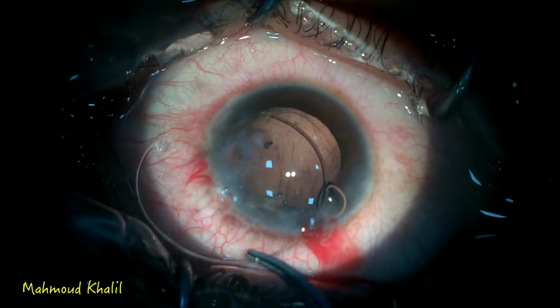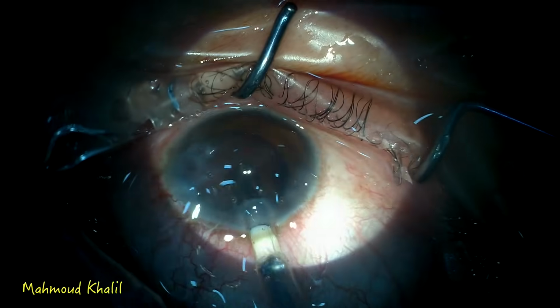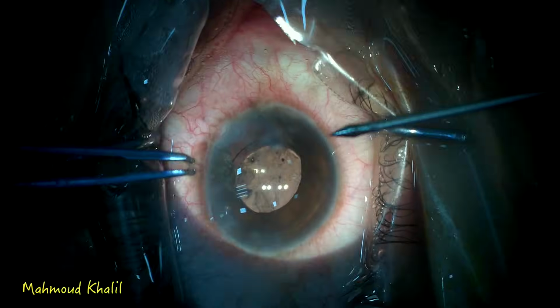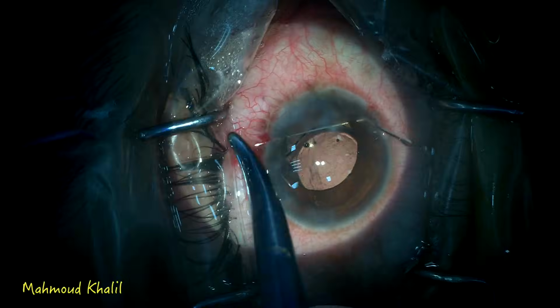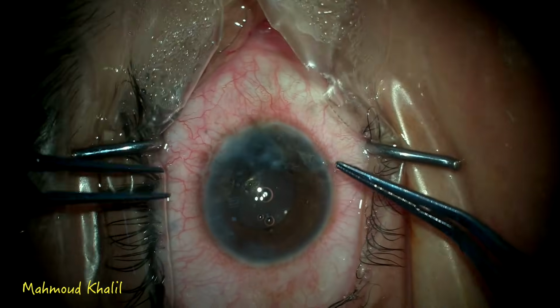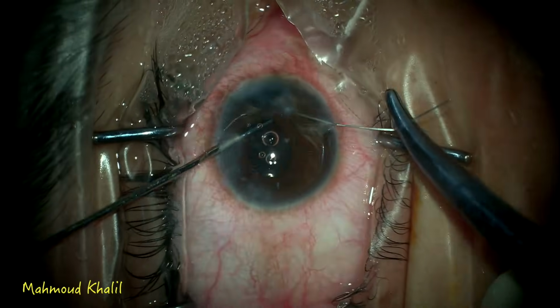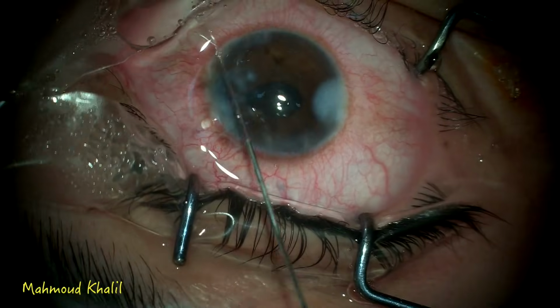The lens is subluxated, as we see, so we put a capsular tension ring to support the lens and then implant the IOL. As you see, the iris is injured, so we do a pupilloplasty to repair the iris and to regain the normal shape of the pupil. Doing a four-throw pupilloplasty.